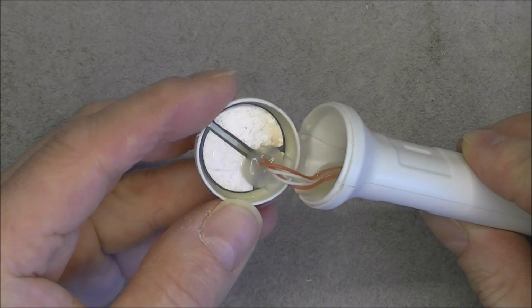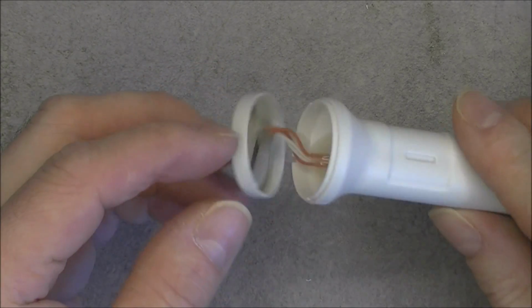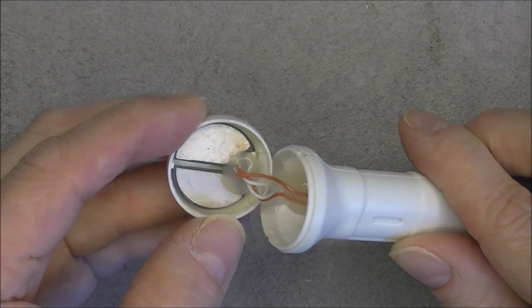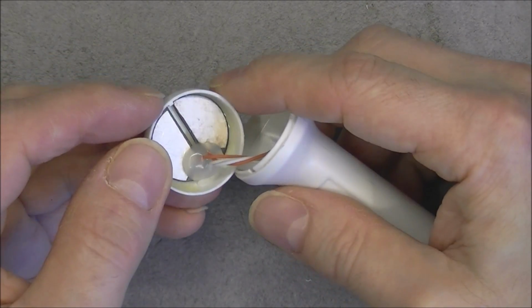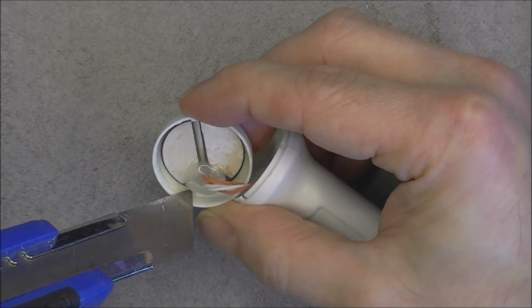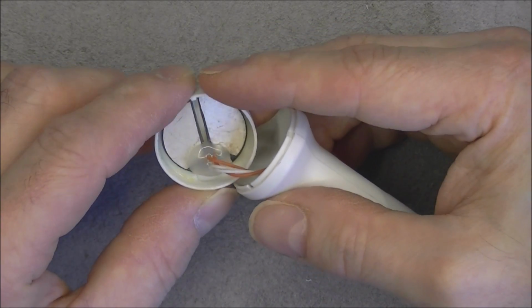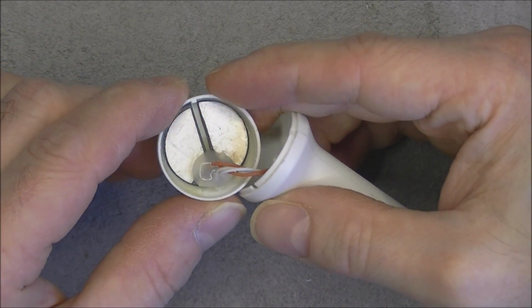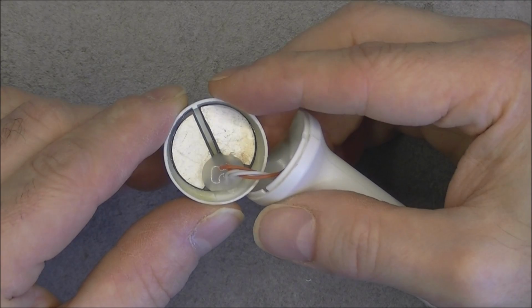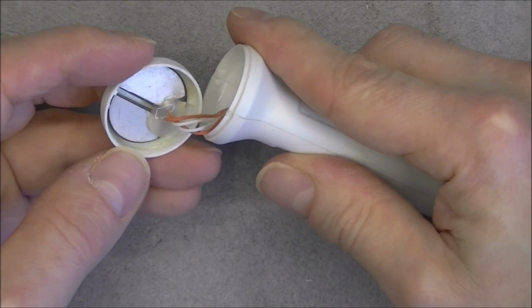We can see some kind of piezoelectric ultrasonic components. 4 wires going to them, and I guess we have 2 half circles, so probably one transmitter and one receiver. But they are glued to the front piece, and they are just some kind of ceramic discs with silver coating on them. Well, probably not ceramics, probably some kind of special material to generate the ultrasounds.